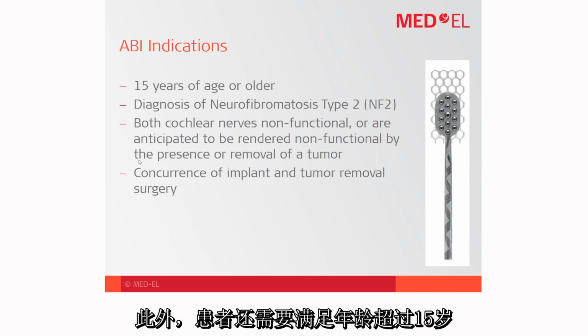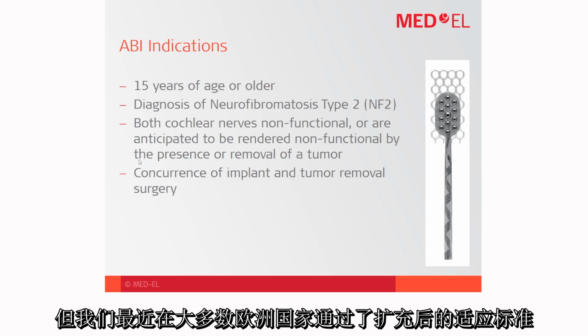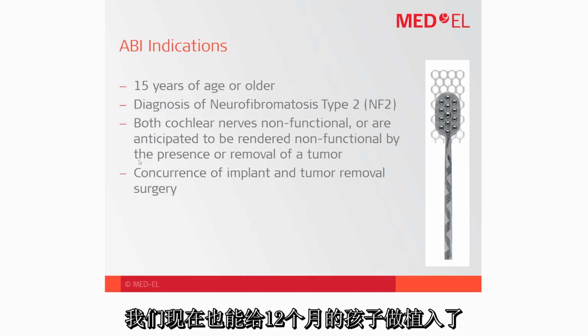The patient has to be 15 years of age or older, although we recently received approval for expanded indications in CE marked countries, so in European countries mostly. Typically, the age should be 15 years or older, but with the expanded candidacy criteria, we can implant in patients who are 12 months or older. Now, this candidacy criteria differs region to region, so if you have any questions about this, please contact your local MED-EL representative directly.